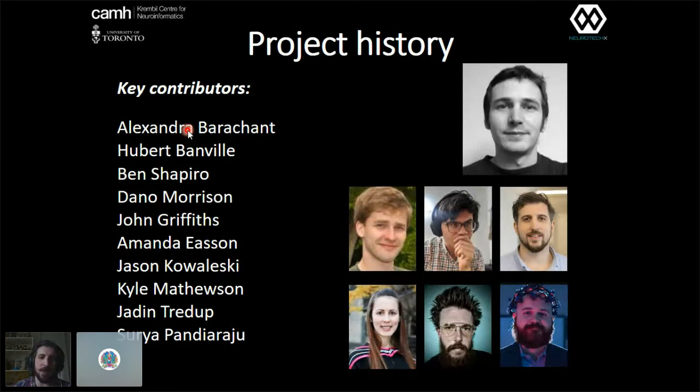And then a few other people that I've highlighted here with some pictures. I'll read them out. So Hubert, who is with us today at BrainHack, Dano, who more or less brought me into the project a few years ago. We spent some fun time in some cafes in Toronto in the summer around 2016 with Muse EEGs on our heads, trying to get some code down to get all this stuff working.